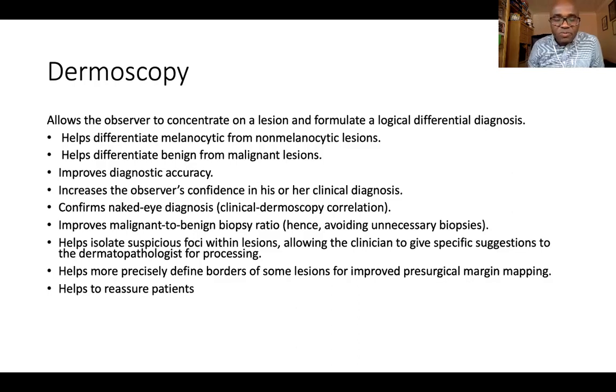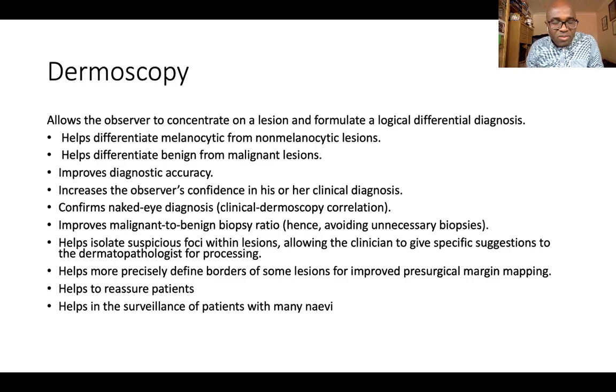You can use dermoscopy to appreciate what the darkness is in those areas, particularly in something like a solar lentigo, where you see a dark area in the middle. You worry about lentigo maligna or melanoma in situ. Looking with dermoscopy, you can appreciate some features that can help in terms of a biopsy for the histopathologist.